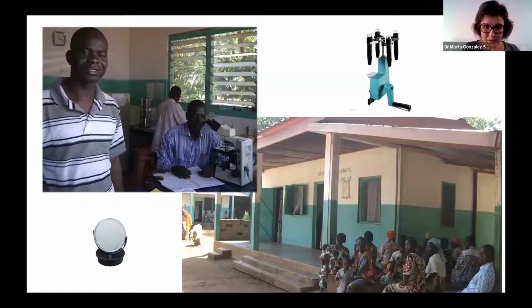And just behind my colleague with the white coat, you cannot see it, but there was the instrument on the top right, which is a manual centrifuge. So, limited things, but we'll see what we can do with them.